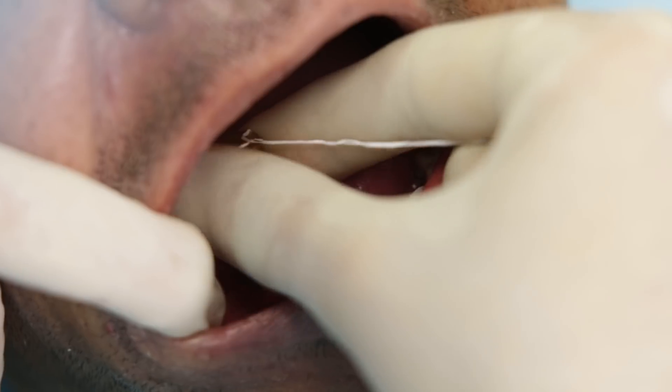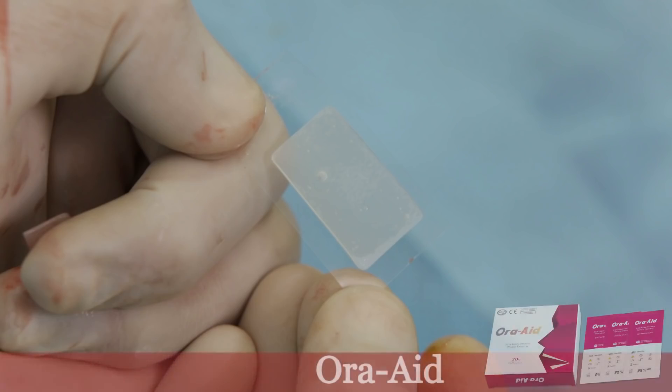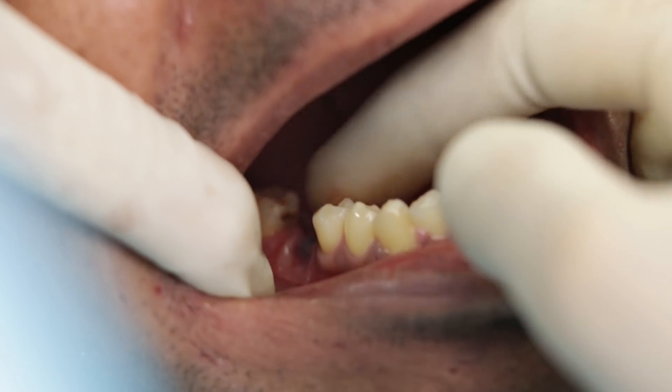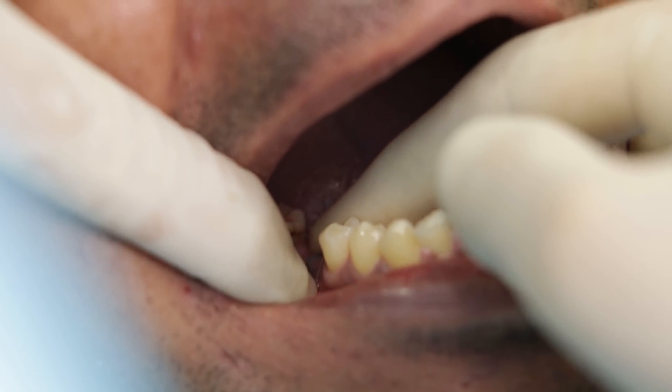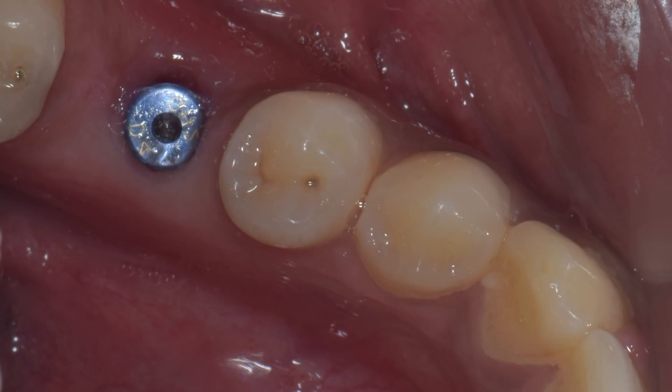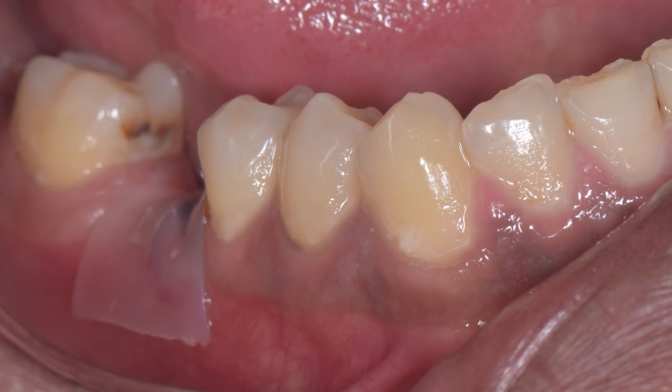Now I am using something very interesting called the Ora Aid, which is a cellulose dressing available with Chairside. This protects the site as there is obviously going to be some inflammation there. It's also a very good choice to use for smokers. You can see how nicely the Ora Aid adapts to the ridge immediately post-operatively.